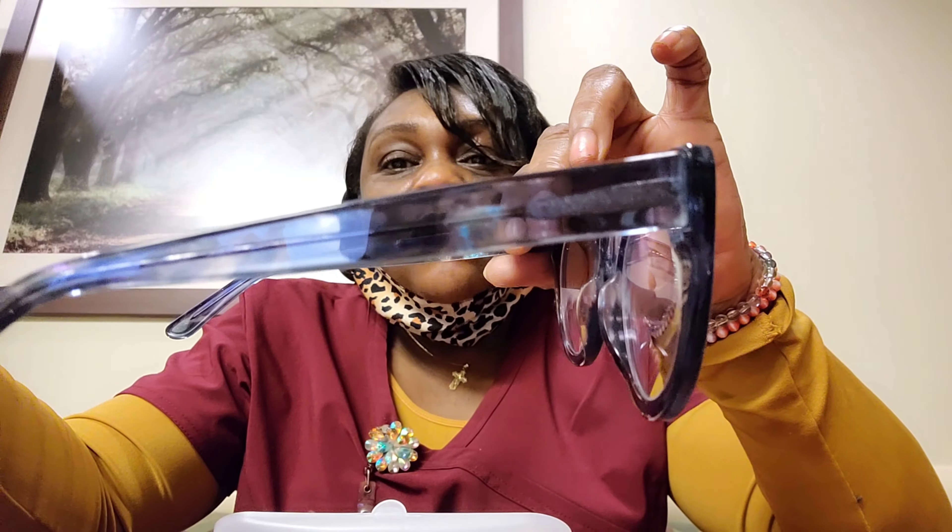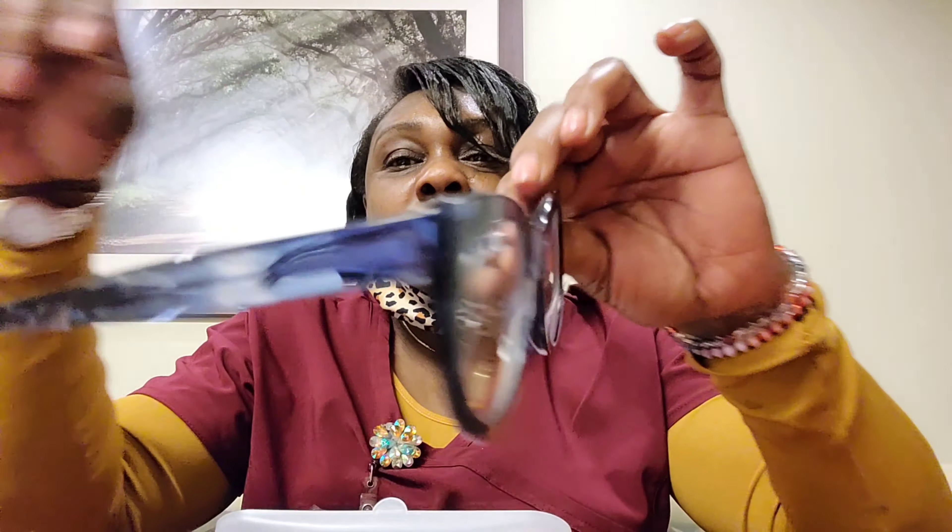These are called the starry cat eye glasses and they have little flakes of blue and white in them. I can't really describe it, but it's almost like a camouflage of blue and white, but they're cute.